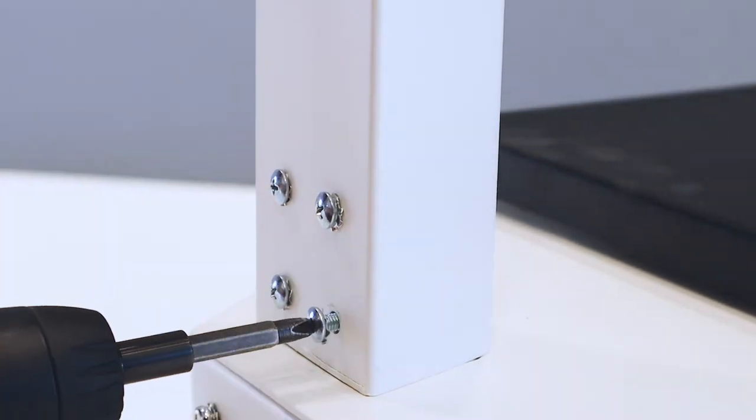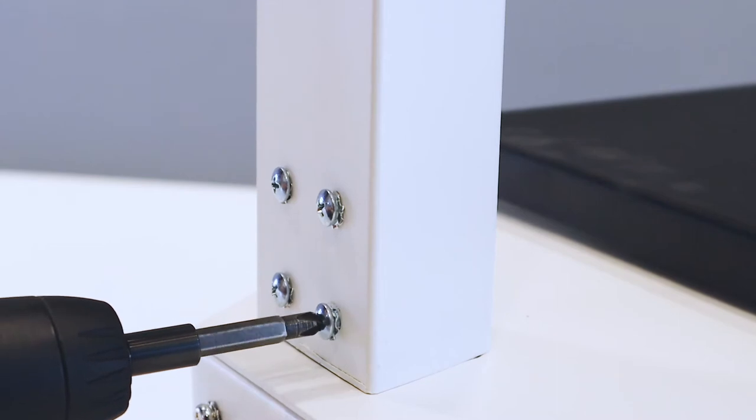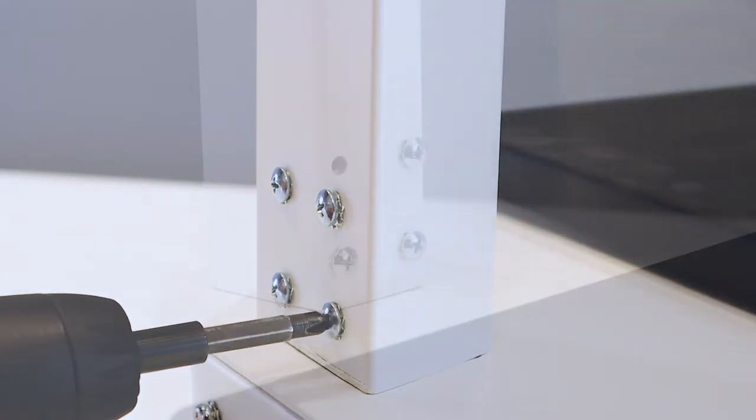Using a Phillips screwdriver, attach the column to the scale base with the eight screws and washers included in the hardware kit.